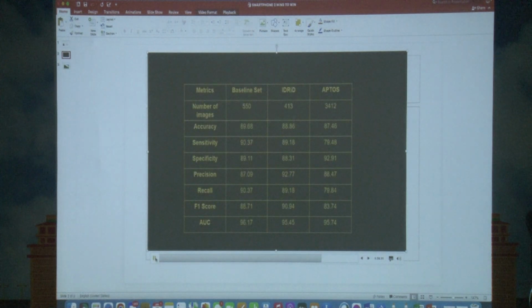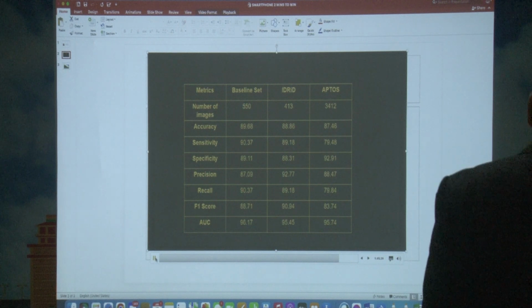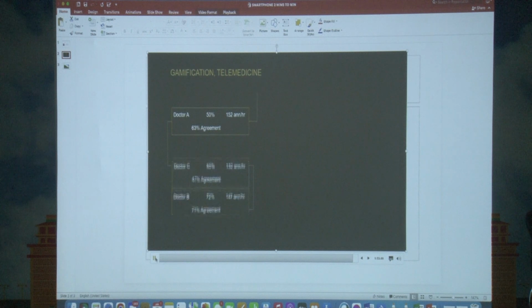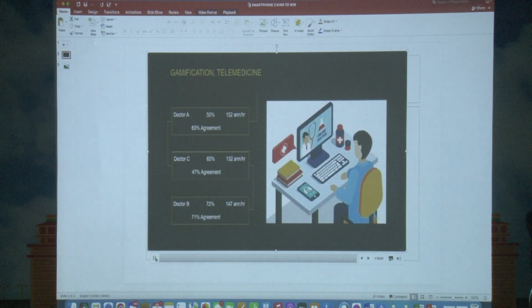We validated the AI algorithms developed using annotations on this tool on some new testing datasets and found them to have really high performance scores. This strengthens our hypothesis that this tool serves no different than a desktop-based tool with the added benefits of being portable and flexible. We wish to introduce more gamification, label optimization, and even use it for telemedicine.